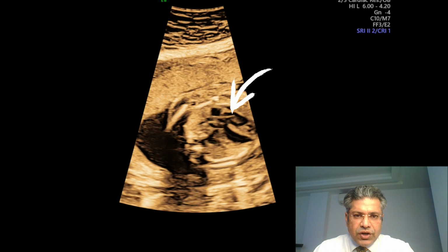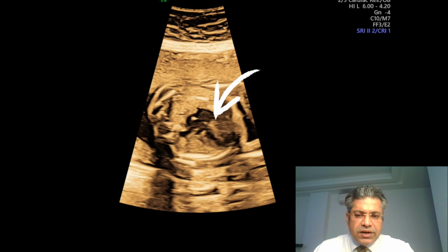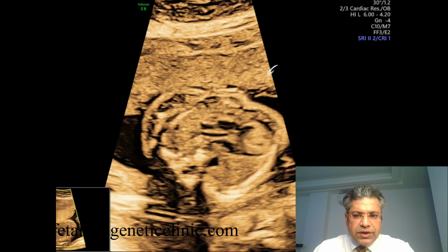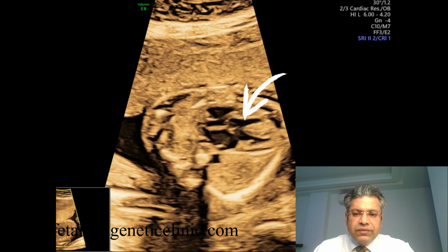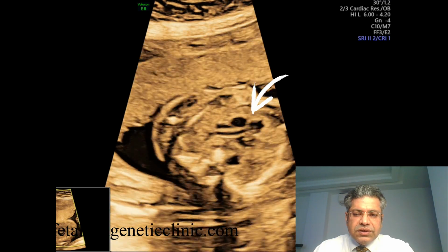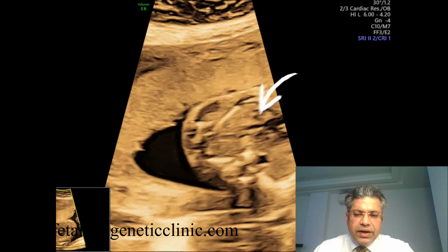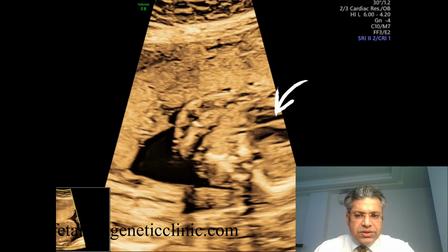So the diagnosis is a pink variety of tetralogy of Fallot, right? The third element is pulmonary artery stenosis, and the fourth element is right ventricular hypertrophy. The RVH is directly proportional to the degree of the pulmonary stenosis or atresia, right? So here it is a lateral four chamber view, and this is the subaortic VSD. Then we look at the aortic override, and we would be in a position to identify the pulmonary trunk and its division, the RPA and LPA. Yes, this is the aortic override, right? So it is a pink variety of TOF, and this can be missed.